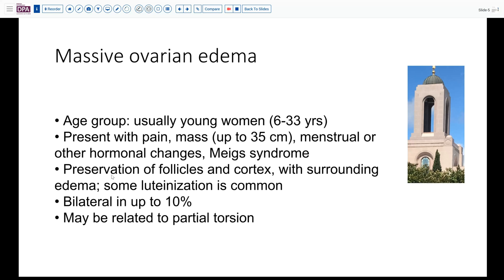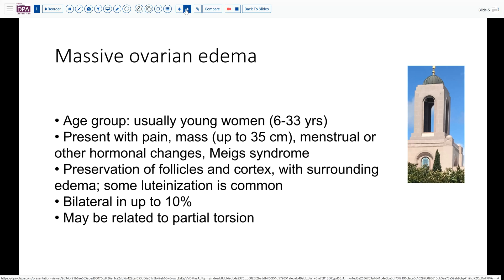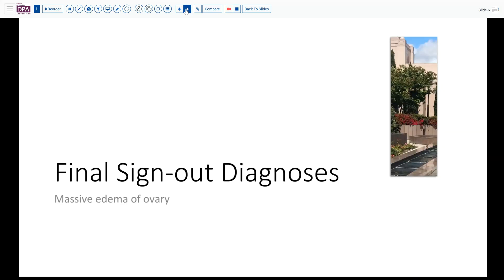Classically the architecture is preserved with follicles and cortex with surrounding edema and sometimes luteinization. Of note, up to 10 percent of cases have been reported as being bilateral. It's not a common lesion but certainly in a young woman it's something to be aware of when you encounter a large ovary for frozen section.